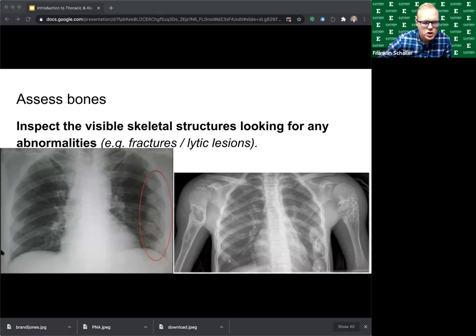So the patient was walking around, tripped on a child's toy, fell on the left-hand side, and had some pain on the left chest. The patient takes Eliquis, vitamin D, and calcium, simply coming in complaining of left side pain. Vital signs are stable. When you assess your patient, you're noticing there's some pretty obvious bruising noted to the left chest. Do you guys see anything unusual on that chest x-ray on the left?